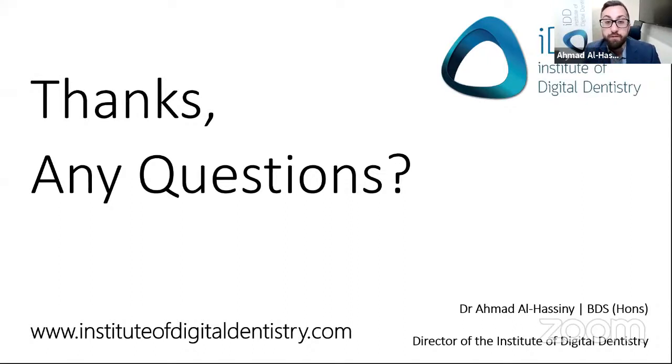I would stick to the defaults, Luis. I don't know why you're having mixed results, and it's hard to say what those mixed results are. The tricky thing is if you scan and send, it's hard to say whether the lab is designing wrong or you're taking the occlusion wrong. The best advice I can give is, if you're constantly getting occlusal issues, start taking full arch scans and take a bite scan of both sides and give that to your lab. If you're still getting occlusal issues from the restorations, it might be your lab.